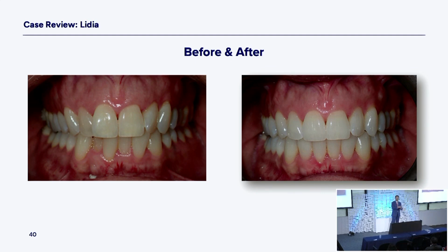Then at that hygiene visit, they're going to come back later. Now again, 1 hygiene visit in the middle, we see them at the end. That's why it's 2 visits. It's 2 aligner visits and 1 hygiene check. But the hygiene check is a profitable visit. That's profitable in hygiene. That's not an aligner check visit. You're just taking a look at having the whitening gel. So we do a box of whitening gel at the beginning, the middle, and the end.